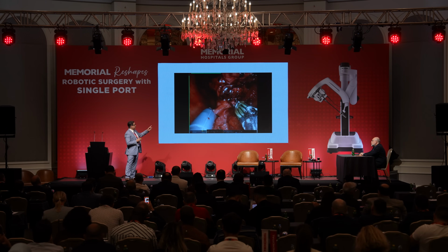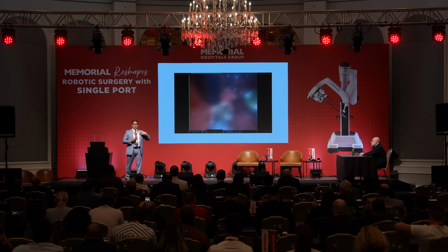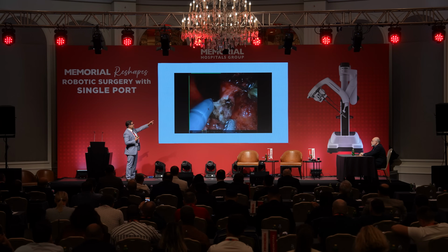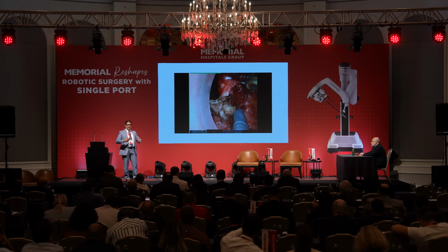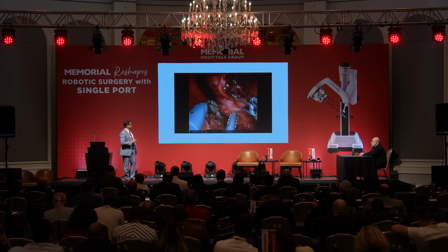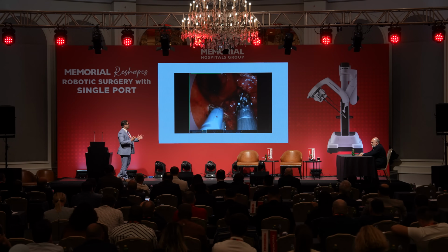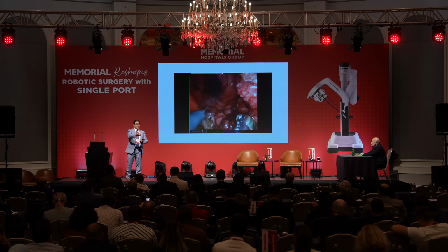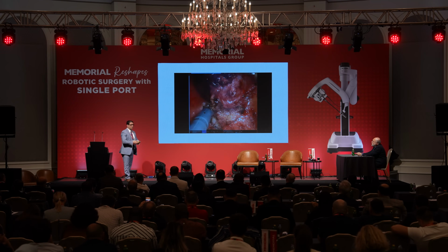So this video here, for honesty, this is not me. This is one of my prior partners at Mayo Clinic. He is using the Xi as multi-port through the anus to take a polyp out. And you can see the movements are really, really smooth without a problem. The way you can hold the needle from any angle and you can sew, it's amazing. It's so helpful.